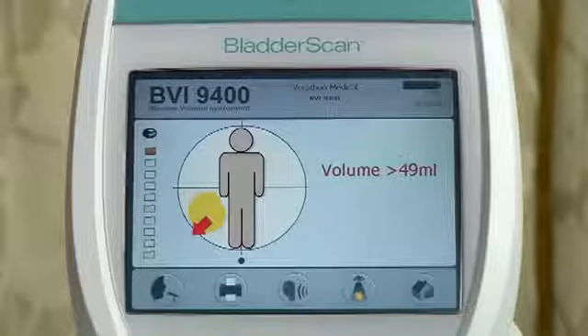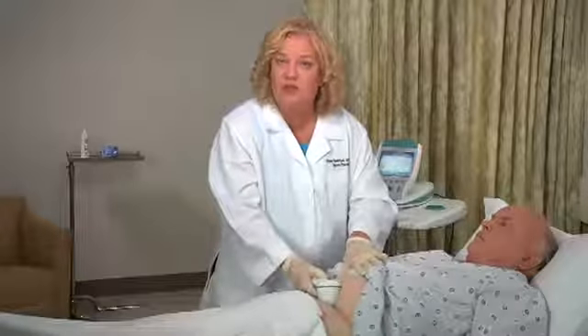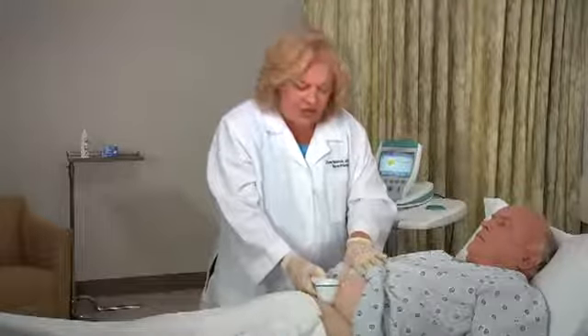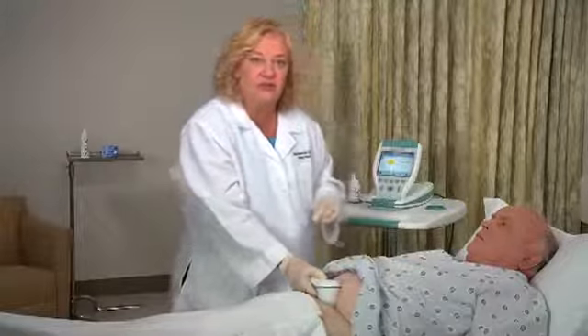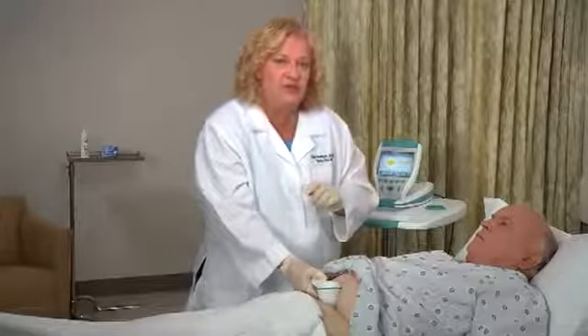Note that the 12 o'clock position on the console target coincides with the orientation of the patient's head. You may also see a screen indicating the pubic bone is inside the ultrasound cone. If this occurs, you may want to re-aim and re-scan. Although the bladder may appear centered and your measurement could be complete, there is a possibility that the pubic bone is obscuring some of the bladder. By re-aiming, you can ensure that you have captured the bladder fully inside the ultrasound cone.